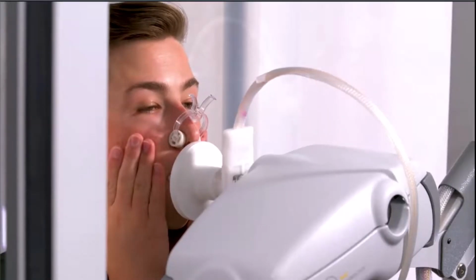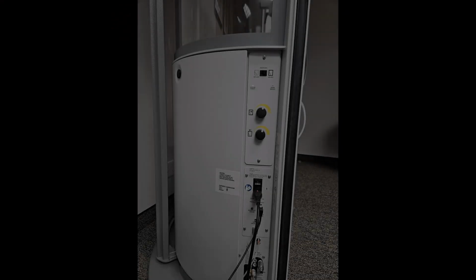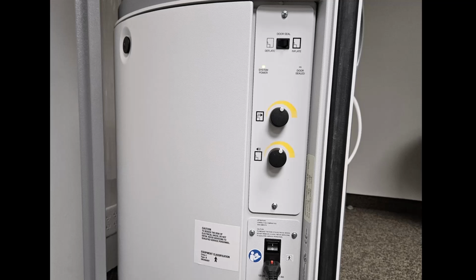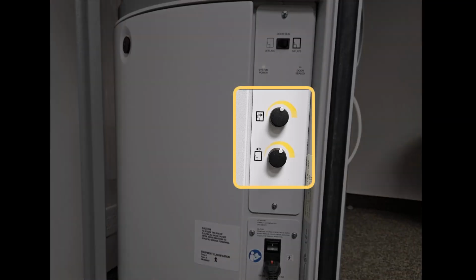If your patient is cooperative, they can place their lips on the mouthpiece after the door has been closed. When the door closes, the intercom between the technician and patient becomes active. Make sure the patient can hear you by adjusting the volume within the cabin by using the volume adjust knobs on the left side of the body box.